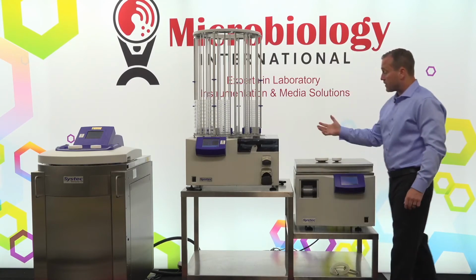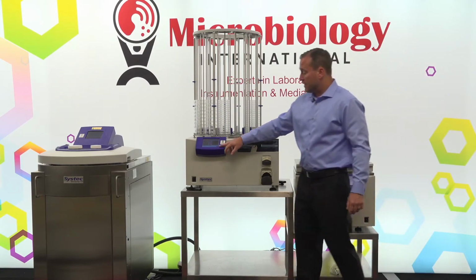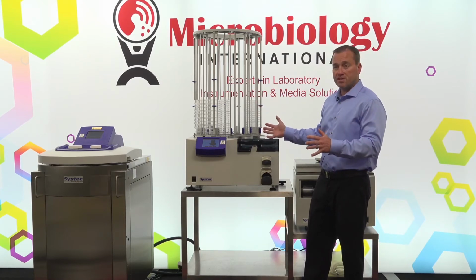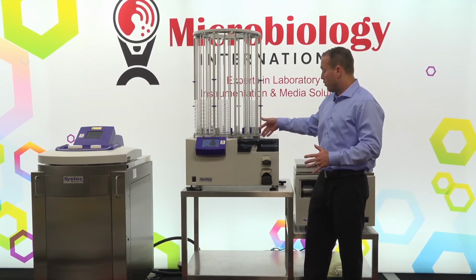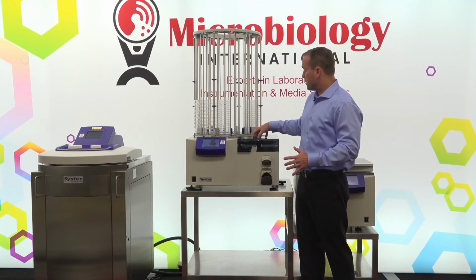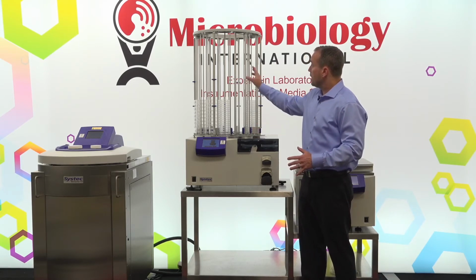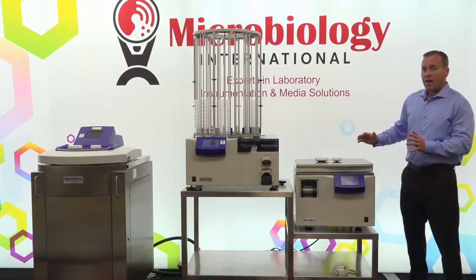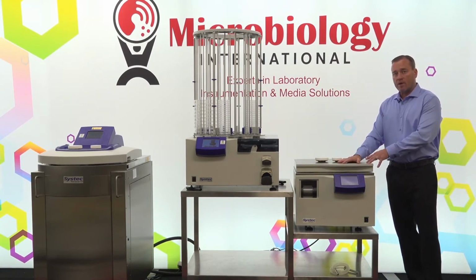So now we have it back to a plate pour. That would show you exactly what we would need to change if we were going to go to a 60 millimeter plate. Simply change the revolver, the piston and stack, the piston feet, and then also the carousel. So at this point, I'd like to go into the programming of the MediaPrep.